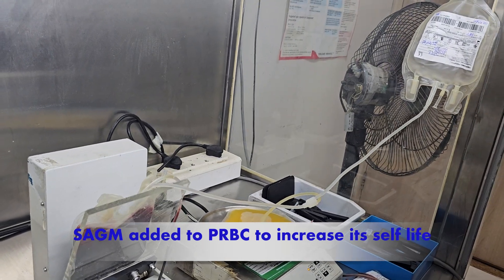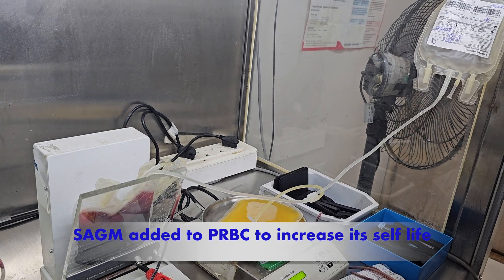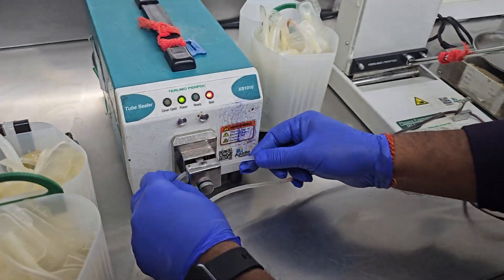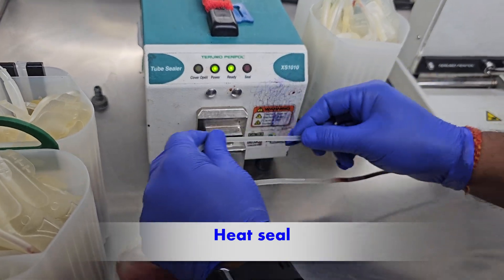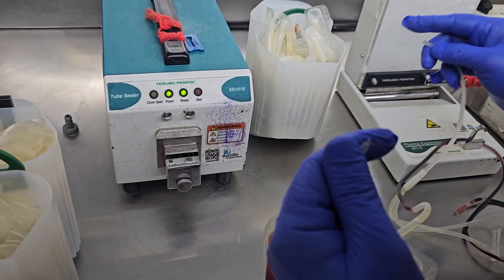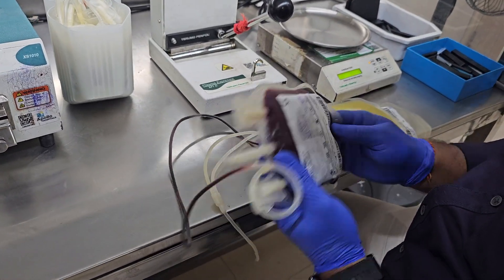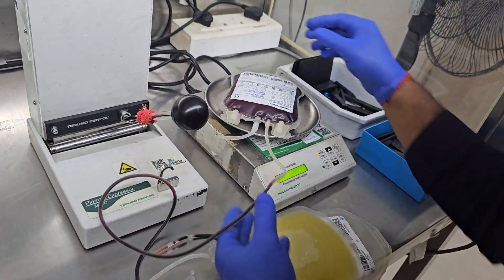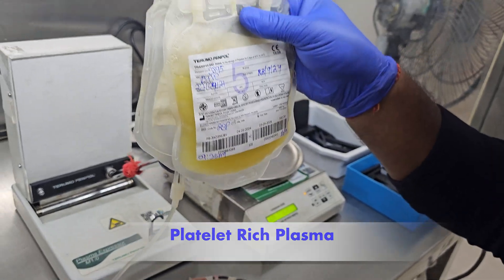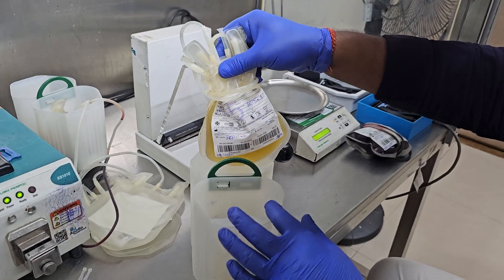After separating, SAGM is added to the pRBC to increase its shelf life and the pRBC bags are separated. Now the remaining platelet-rich plasma is again put inside the centrifuge bucket for centrifugation.